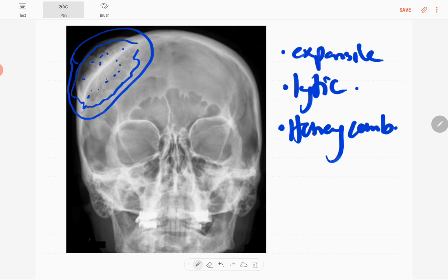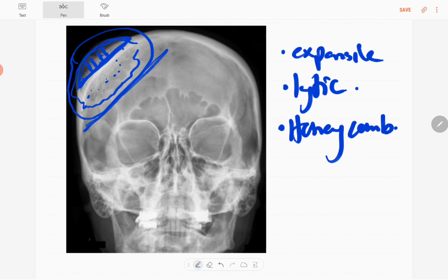Honeycomb appearance is there. There is possible breaching of outer table of the skull in this region and it has narrow zone of transition and sunburst-like appearance due to extension of the trabeculae outside the outer table of the skull.